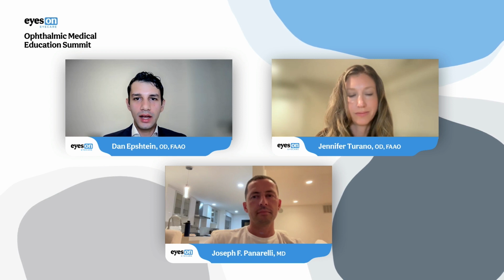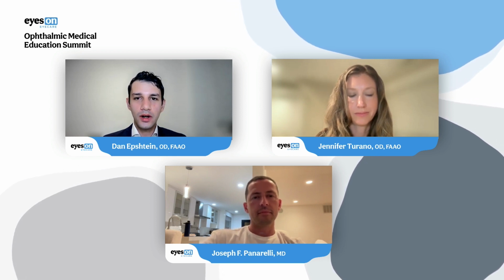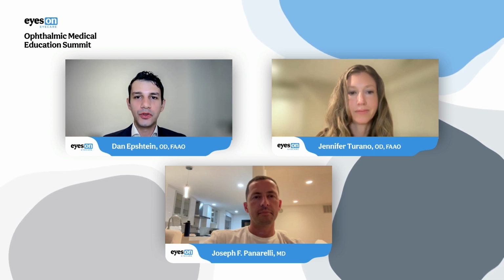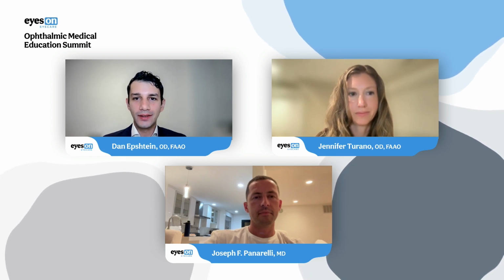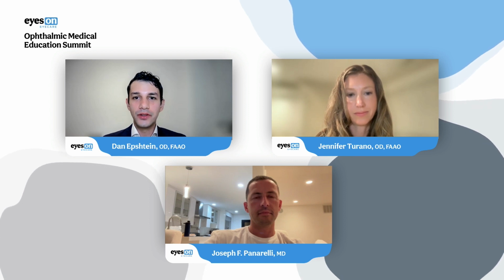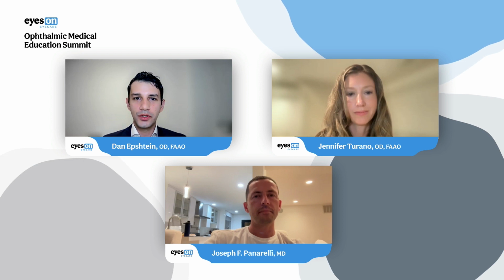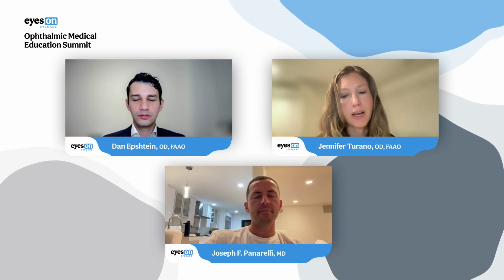In glaucoma, I think the major question is, are we losing those blood vessels before, during, or after we lose those RNFL axons, before we have ganglion cell atrophy? So until we answer that question, I don't know if it's that useful for our day-to-day clinical glaucoma cases, unfortunately. Anything to add, Jen? I would agree with you here.